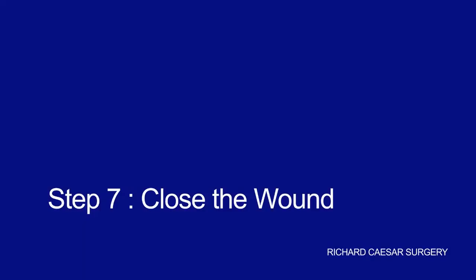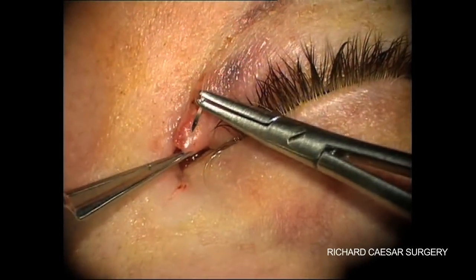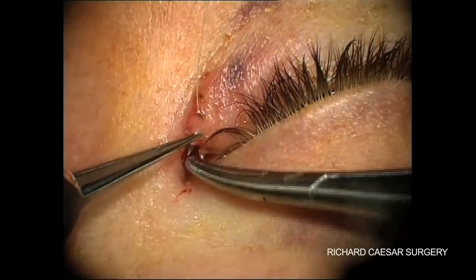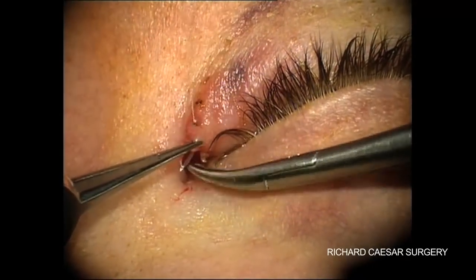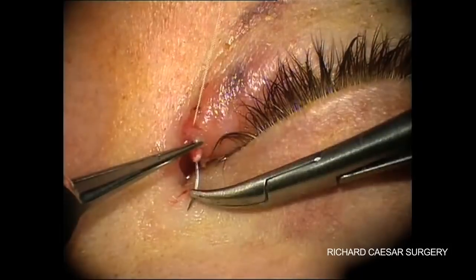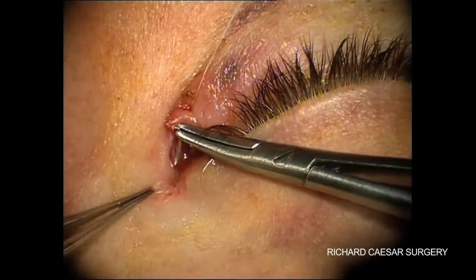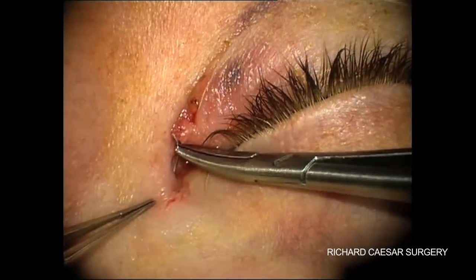And at this point, all that's left is to close the wound to bring the lacerated skin back to its original position, such that your patient gets hopefully a very good cosmetic outcome, as well as a very good functional outcome.